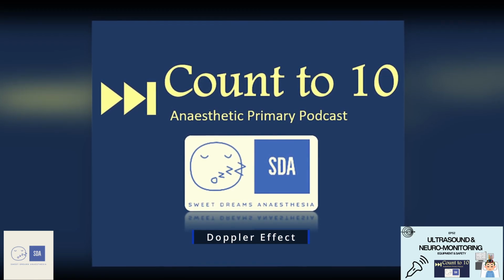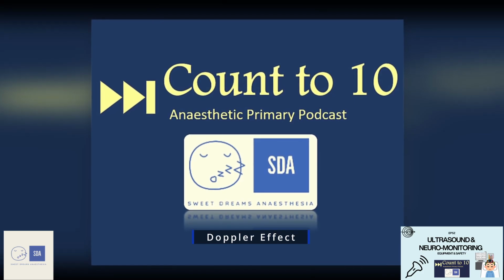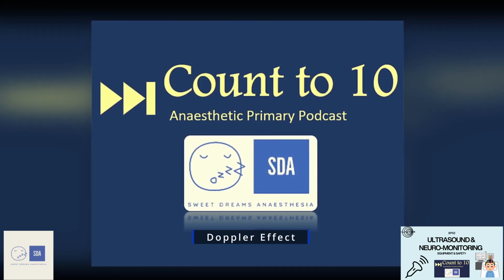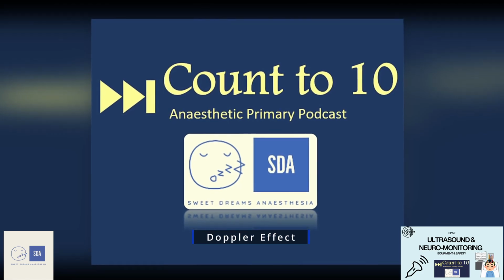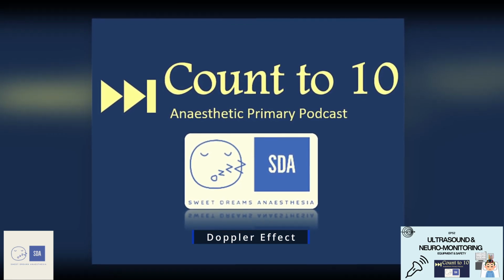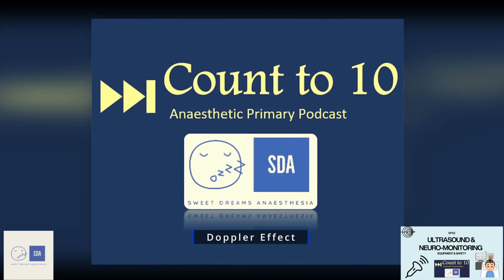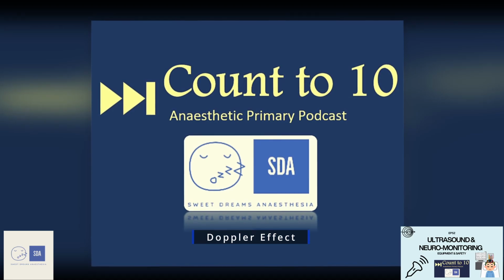Going back to why Doppler mode is also useful in telling us if blood is either moving towards the probe or away from the probe, this allows us with the color Doppler mode to figure out the direction of blood. And the simple acronym to remember is BART, which refers to the color blue moving away from the ultrasound probe and red towards the ultrasound probe. So red and blue on color Doppler ultrasound don't refer to arterial or venous, but rather the direction of blood flow relative to the ultrasound probe.